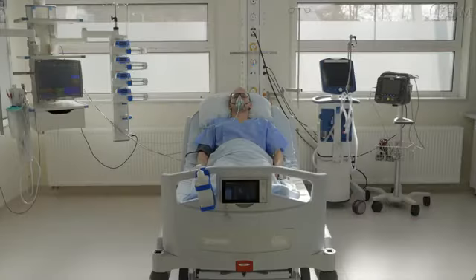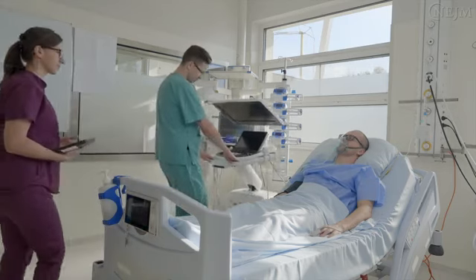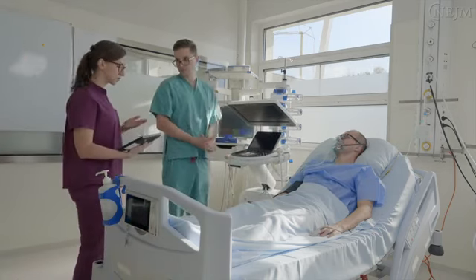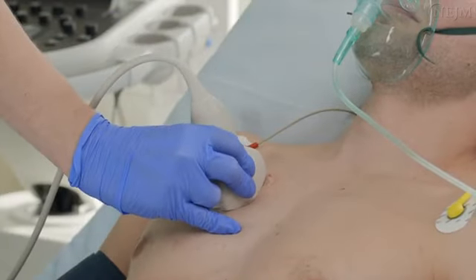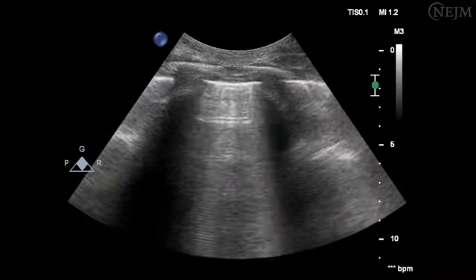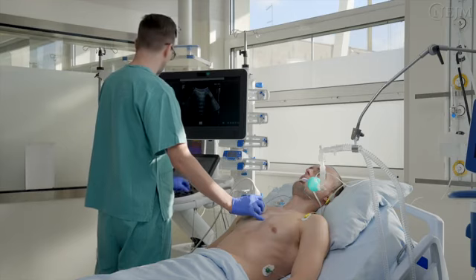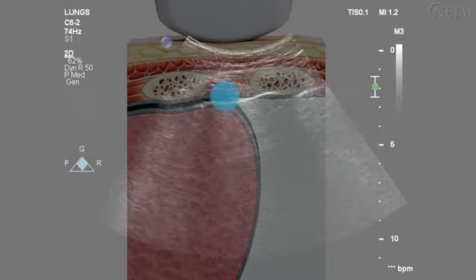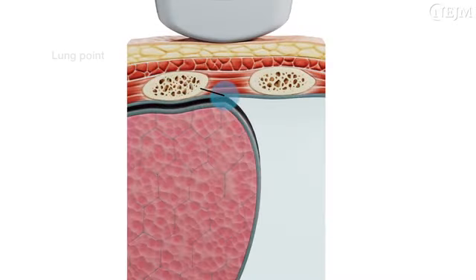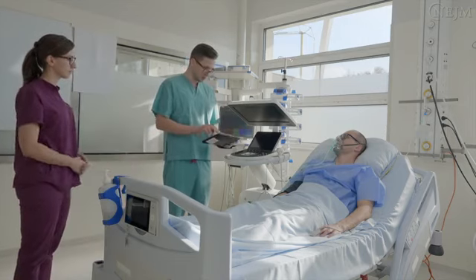Lung ultrasonography is an easily used, well-established, broadly accessible, and cost-effective diagnostic tool. Its major benefits include bedside availability as well as outpatient availability, the capacity to assess for a wide range of causes underlying respiratory failure, usefulness for monitoring treatment course, for example, the change in observed findings, the areas in which they occur, and volume of pleural effusion, and its rapid detection of life-threatening conditions such as pneumothorax. Lung ultrasonography also has the advantage of being a safe means of examination for both the patient and physician.